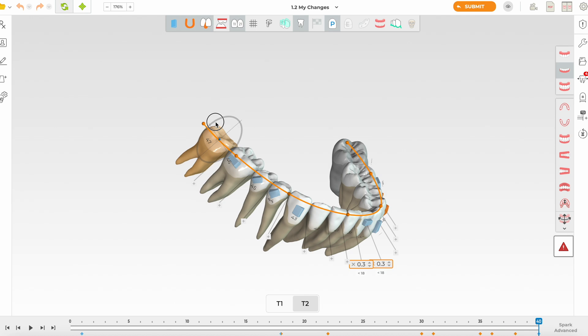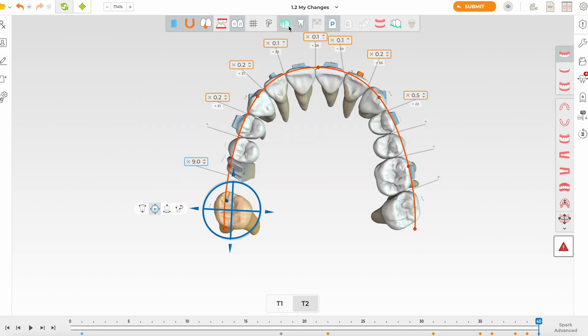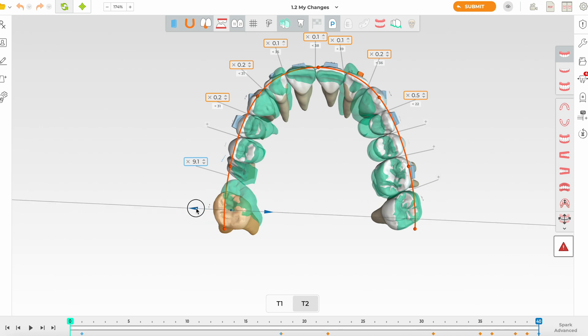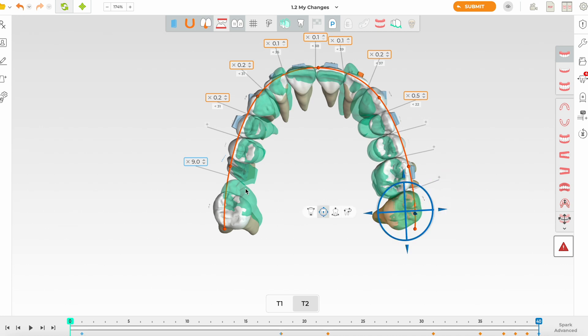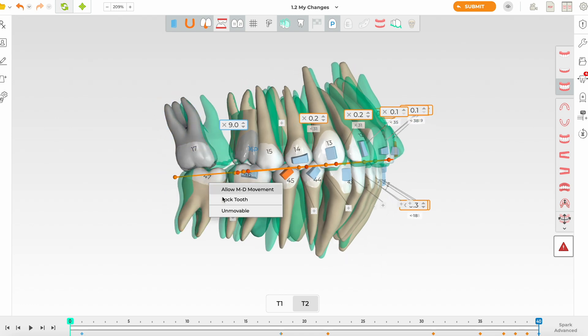Adding some buccal root torque and checking again — it still looks like it's in crossbite, so we need to move it a bit more buccally. Checking how much buccal movement we've done — it was almost nothing, so I'm confident we can move it more. Looking at the sevens, the arch symmetry is looking good. The premolars look well-positioned and I'm liking the overall arch form now.